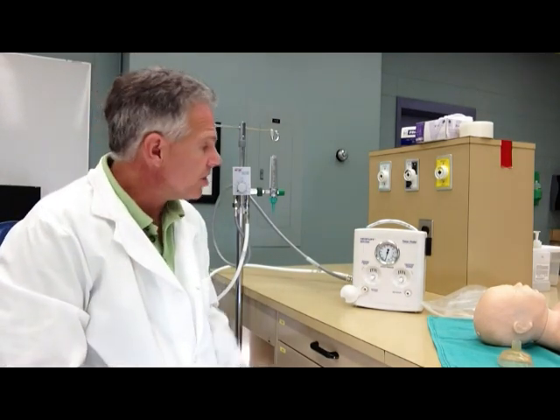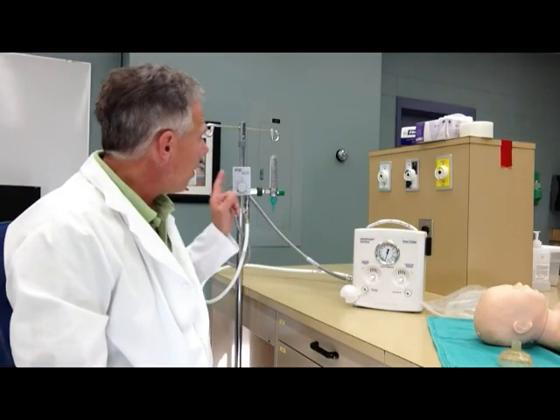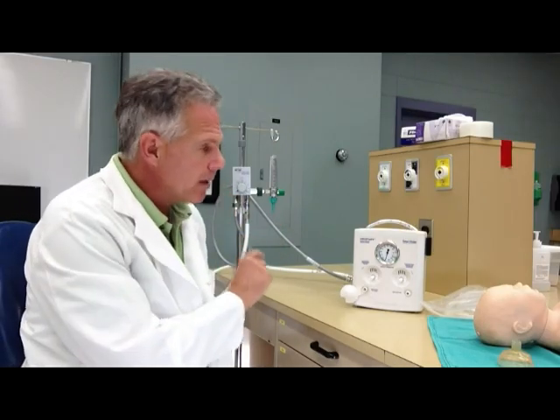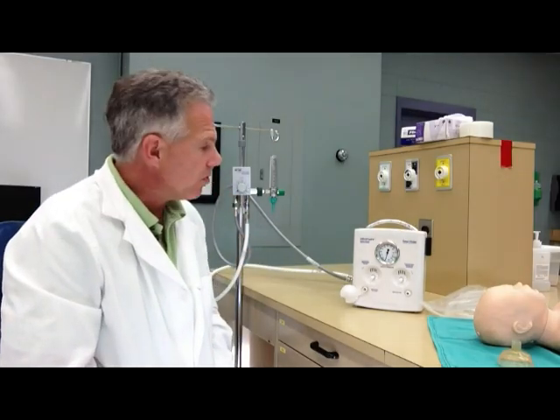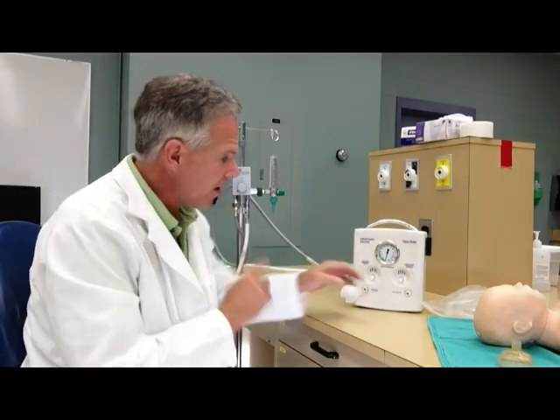Hi. I'm going to do a little demonstration for you on how to set up the Neopuff mechanical ventilator for a neonatal patient. The first thing we're going to do is use a blender today because I want to be able to adjust the FiO2 to be delivered to the patient. The Neopuff has no ability to adjust the FiO2 itself.